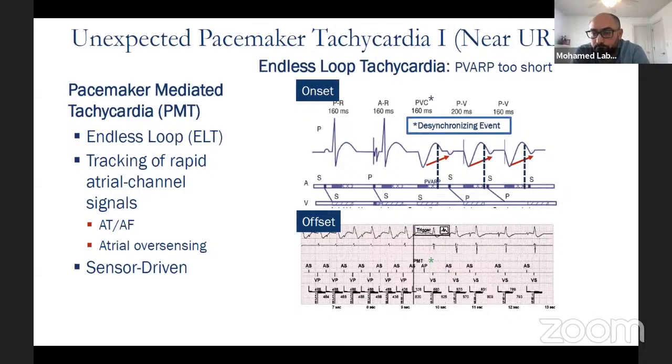An upgrade from a pacemaker to an ICD depends on the scenario. There are a lot of factors that play a role. For extraction, a class 1 indication is infection. Otherwise, extraction has risks. So if the lead is 20 years old, sometimes just leave it there. As long as there's a patent subclavian vein, you can add another lead and just leave it. There's risk and benefit that has to be discussed with the patient. It's a complicated topic. Maybe we can arrange another talk about lead extraction or more on complications of pacemakers.